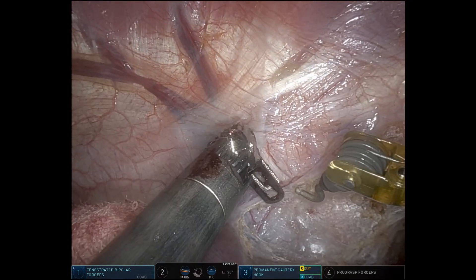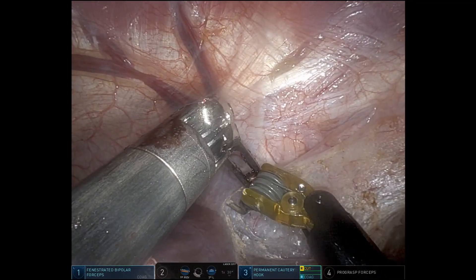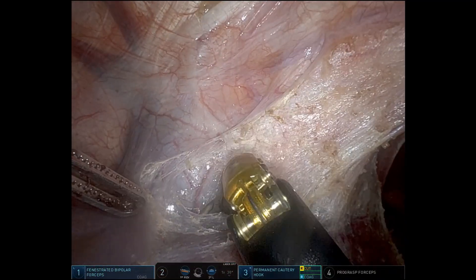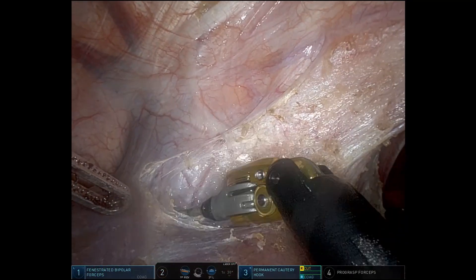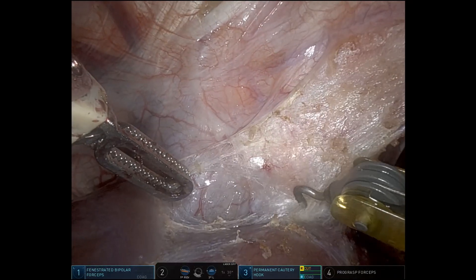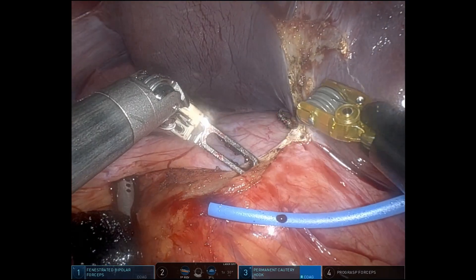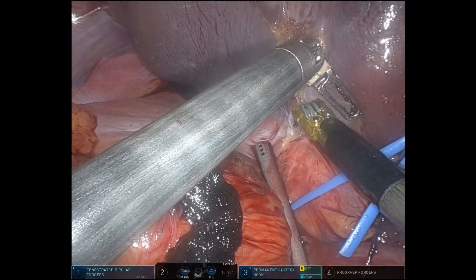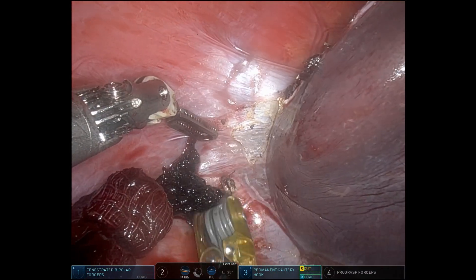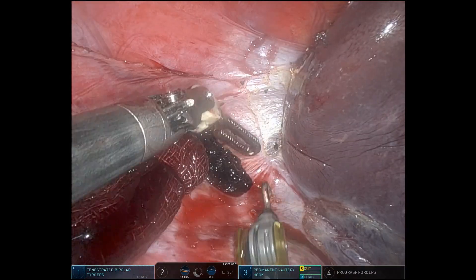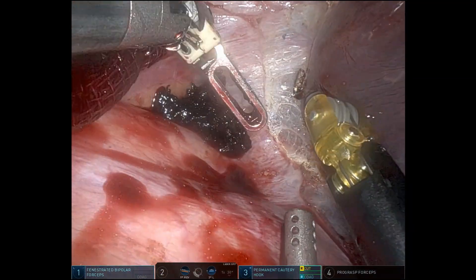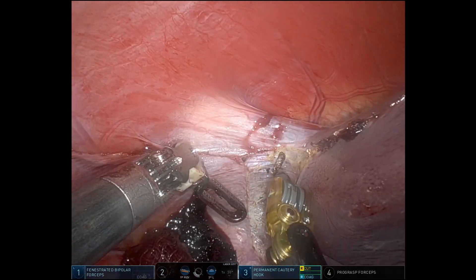Here we're going to expose the veins suprahepatically. Specifically, we're most interested in the right vein and the middle vein — that crotch between the two — since we're planning a formal anatomic right hepatectomy. Here we are dividing the right triangular ligament. Arm four is providing retraction on a sponge to pull the liver to the right, and each time I move it provides additional exposure.